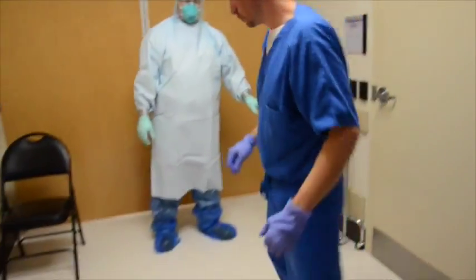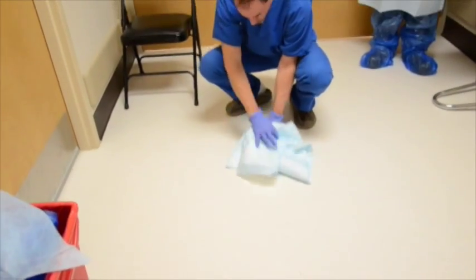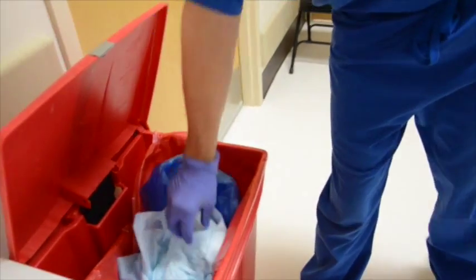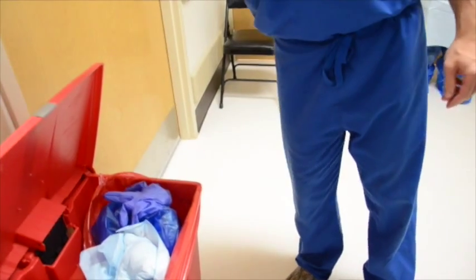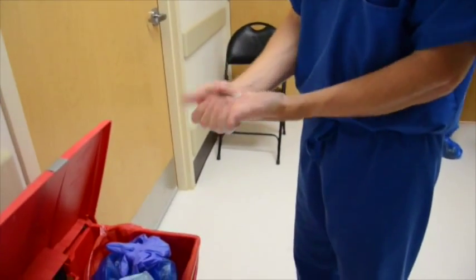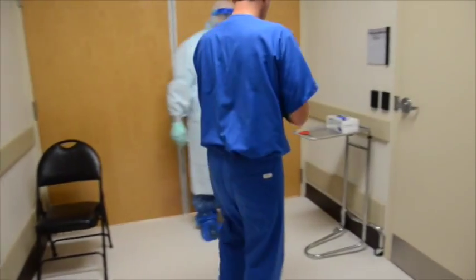Fold doffing pad to inside containing possible contamination and place in red bag waste container. Remove inner gloves using glove-in-glove technique and discard in red bag waste container. Perform hand hygiene using alcohol-based hand sanitizer. Proceed to shower, placing clogs in proper decontamination container and place scrubs into soiled linen hopper.